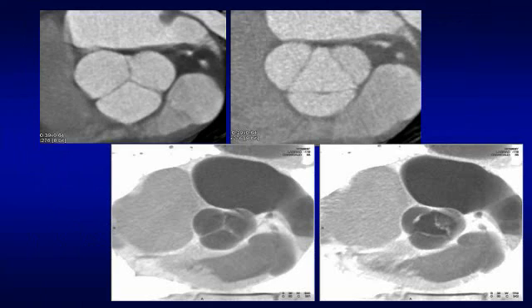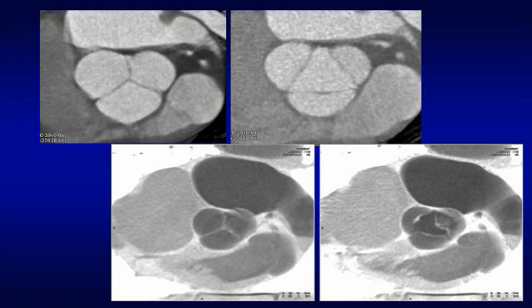Here I have the normal valve on the top set of slides, and below is an abnormal valve. You can see that it is deformed with thickening of the cusps. It's not opening completely, and this is what a diseased valve looks like.